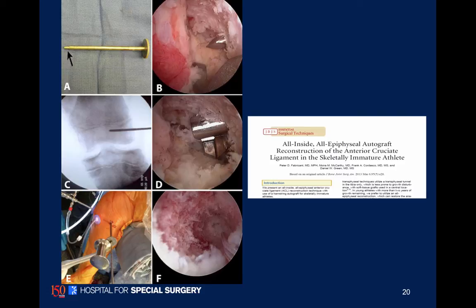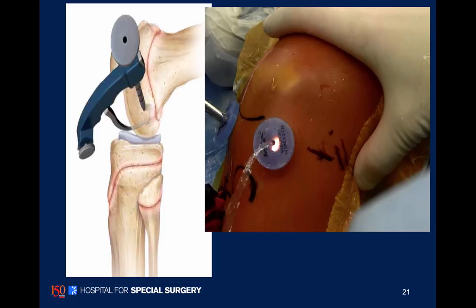As you can see on diagram E at the bottom, we're hammering in that guide. This is a unique drill called a flip cutter — it goes in like a guide wire, then it flips and you drill back toward the guide. That's how you make the socket, and once you've used it once or twice, it's a pretty easy device to use.